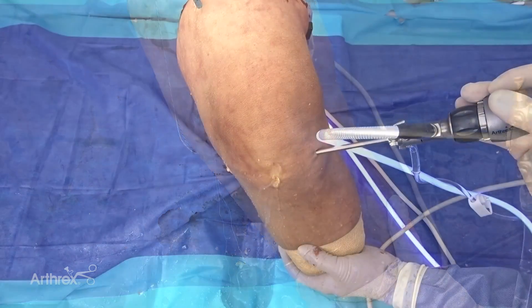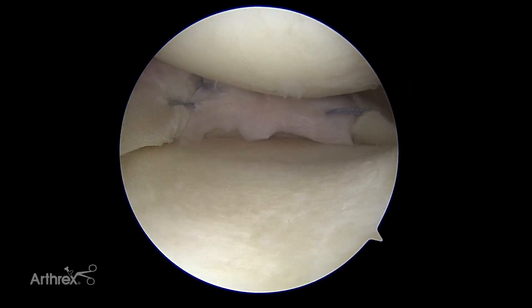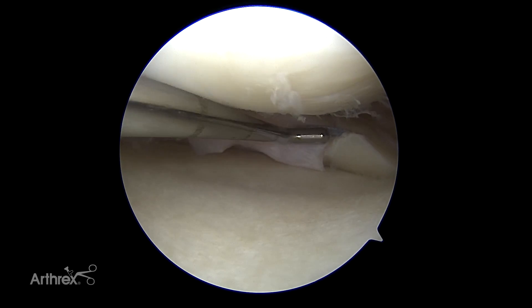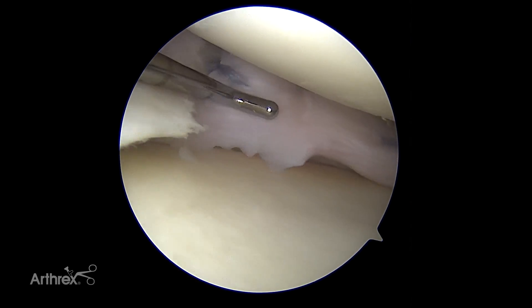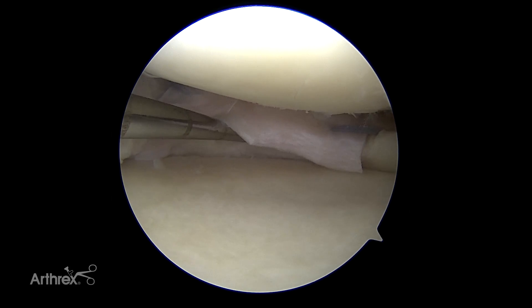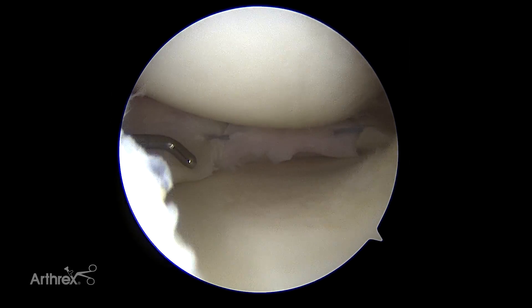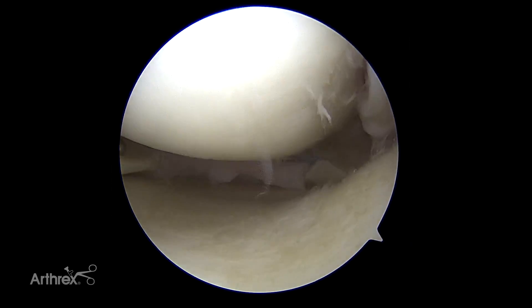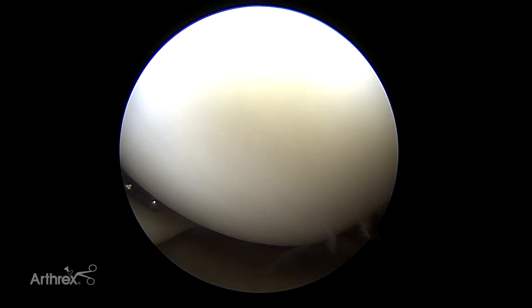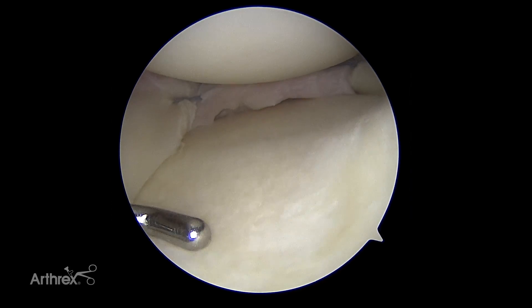Now we'll put one posteriorly. Here's our completed segmental meniscal allograft transplant. I just trimmed a little bit of that back edge — remember this graft was not matched to this patient, but I think we had a very good fit. You can see here's my spanning suture to the posterior horn and anterior horn, two capsular sutures tied, then that additional vertical mattress — so it's totally stable. Can't displace it at all. We've replaced the meniscus. It's pretty normal — I'm really happy with how that came out. Putting the knee through a range of motion: flexion — all the sutures hold fine, you can see the meniscus, the femur rolls back, the meniscus goes with it — normal roll-back. Really happy with that transplant.